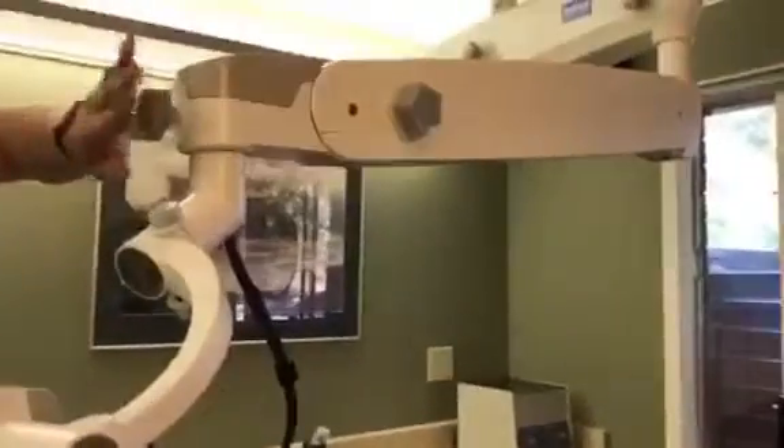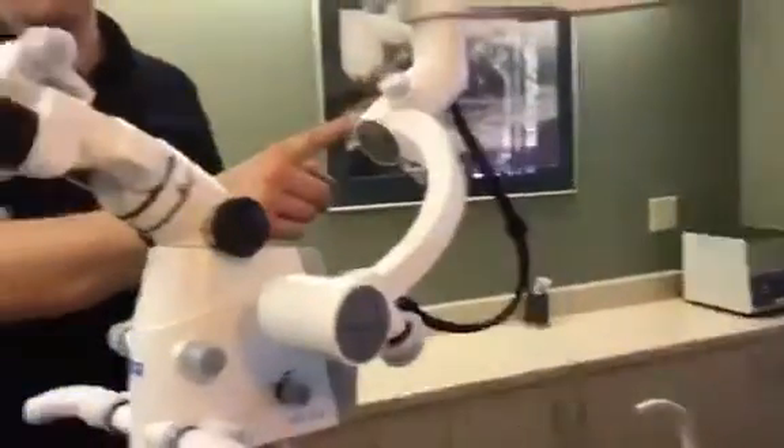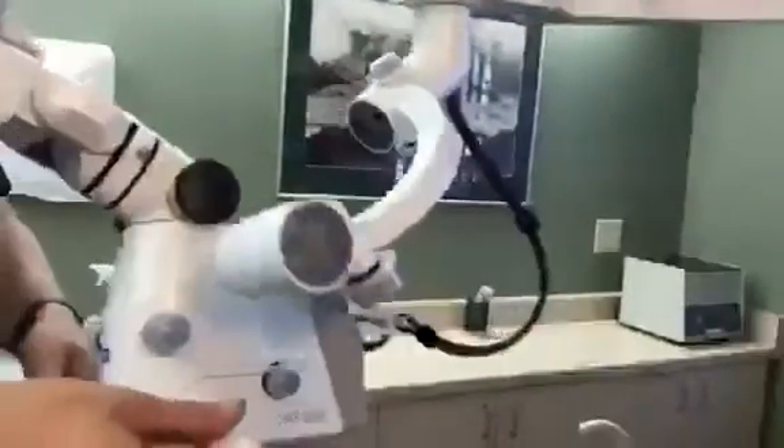You have this last tension knob, and this is the left to right — so this last one controls left and right swing. This pivot adjusts left and right of the microscope head.